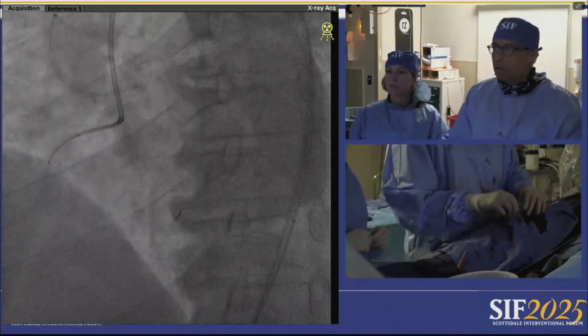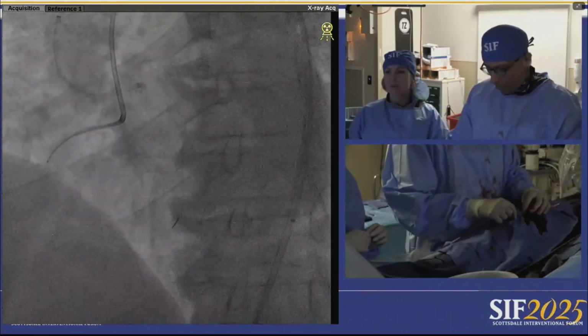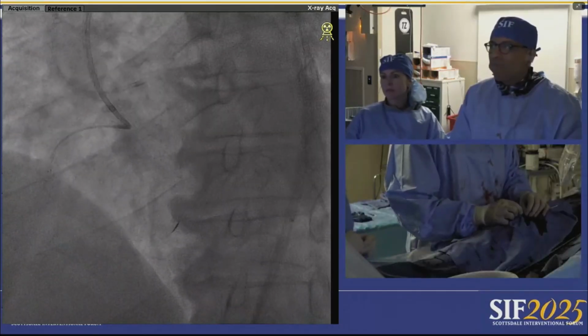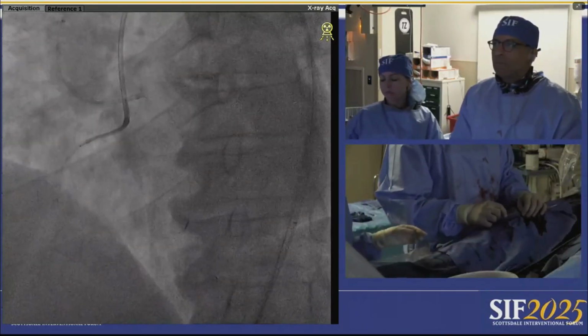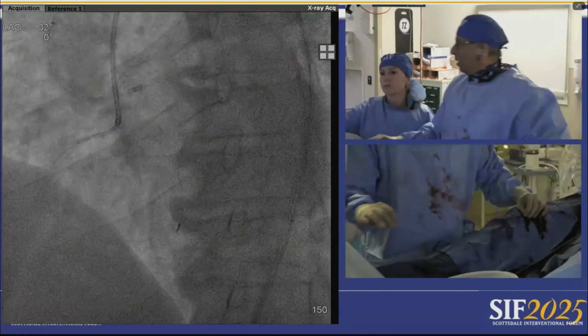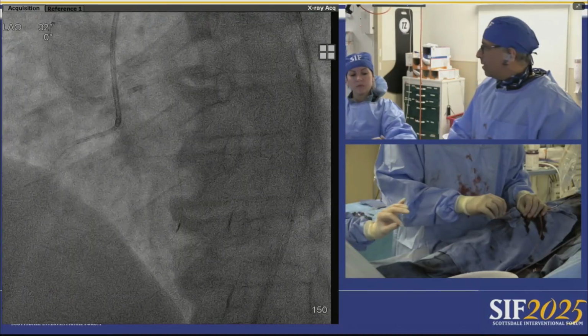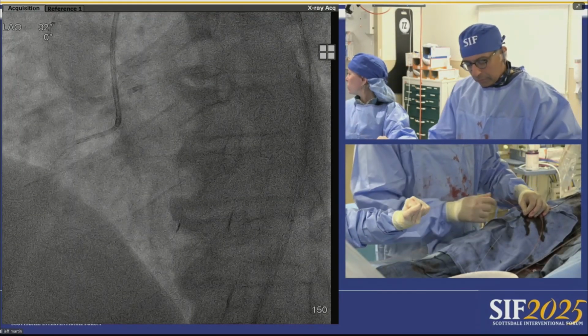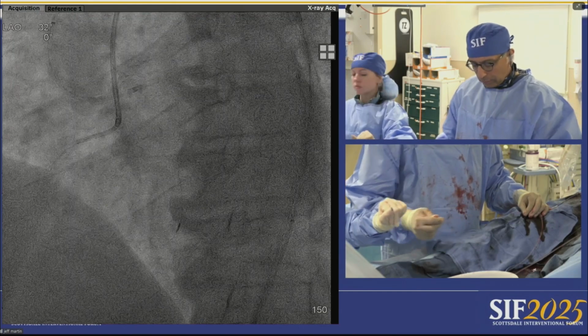You had a 2 and change, maybe 2.5, I couldn't tell from the IVUS, not calcified distal outflow. To your point, Manish, am I dropping 90 millimeters of metal in this, or am I dropping some stent up top and DCB in the outflow? Because once I've stented the CTO and the inflow, if I'm wrong, I can stent the outflow if I need to.